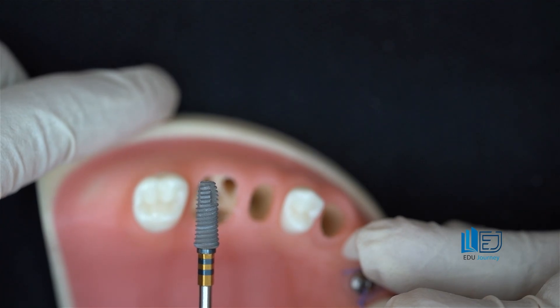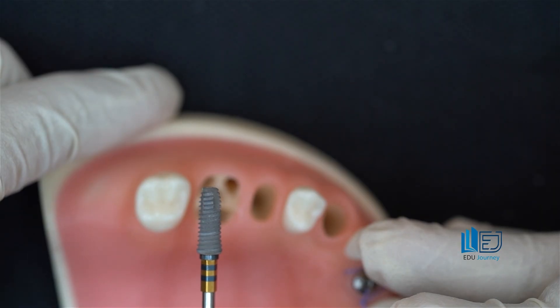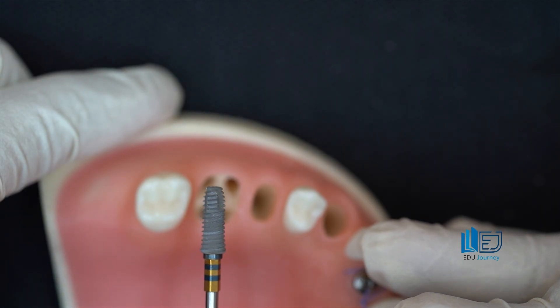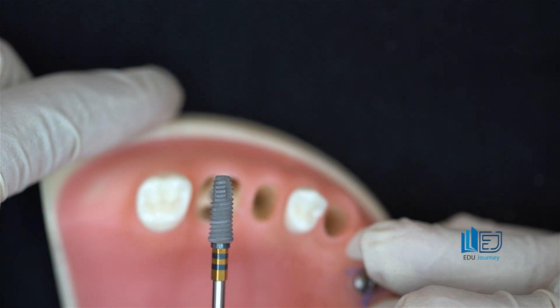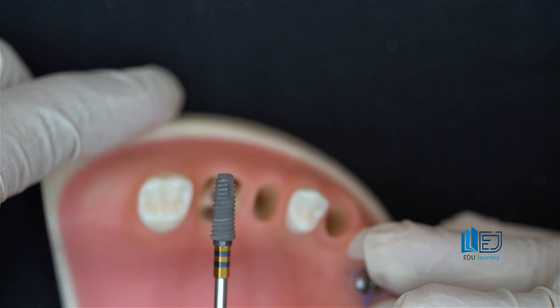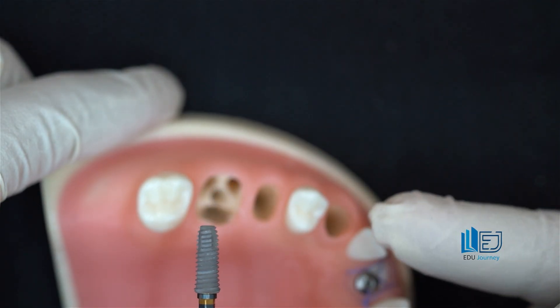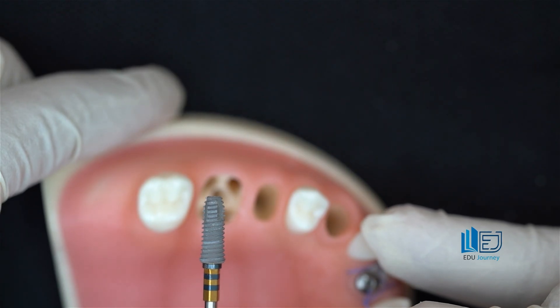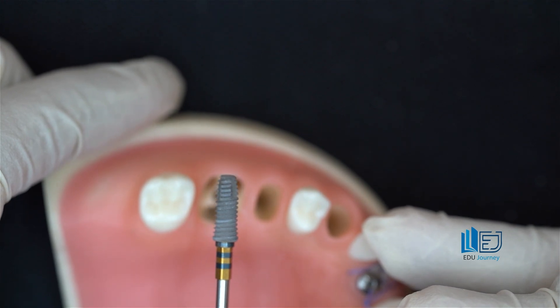Just as with anterior socket preparation, for posterior socket preparation it's better to use fixtures that are more tapered, as this gives more predictable primary stability. When restoring a posterior tooth, using a platform and fixture with a larger diameter — like 4.5, 4.7, or 5.2 — allows for less vase-shaped form and triangular space under the crown, so patients will complain less about food getting stuck. In the anterior regions, narrower fixtures are used, while in posterior regions, larger fixtures like 4.5, 4.7, or 5.2 are more suitable.